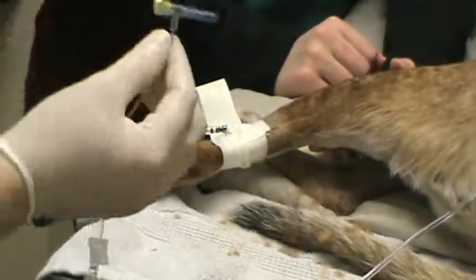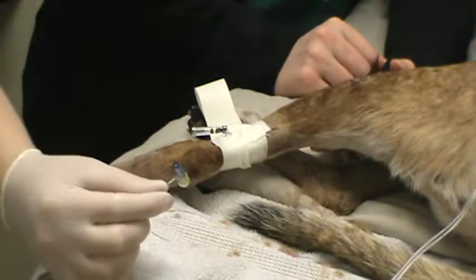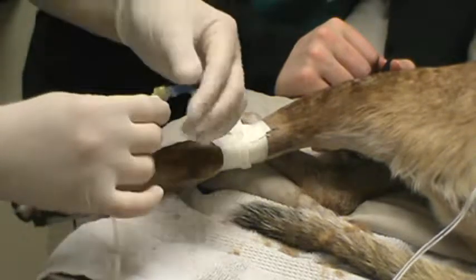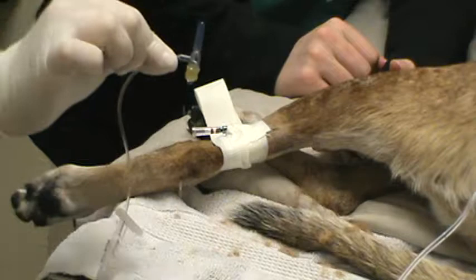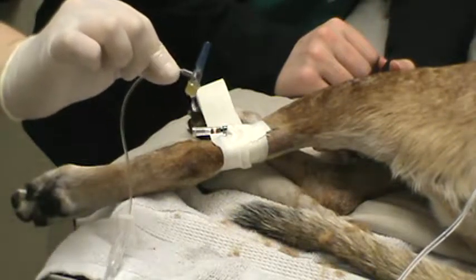And now we can attach our IV fluid line. It's been run through, but I'm going to go ahead and show you that again. So we've run that through, so it's dripping. See it dripping there? Make sure there's no air bubbles in our line.